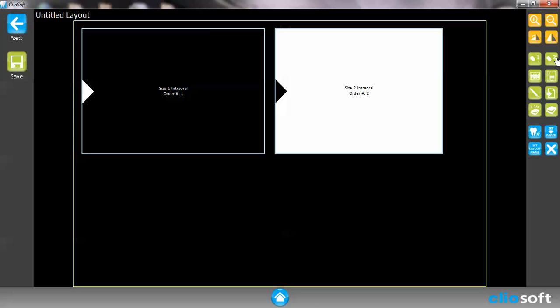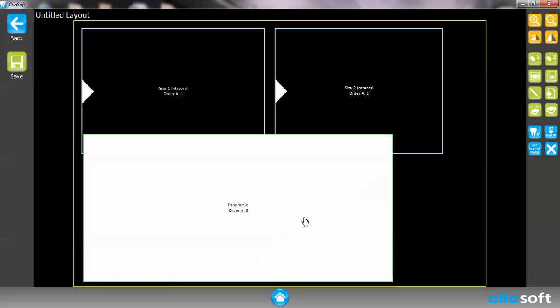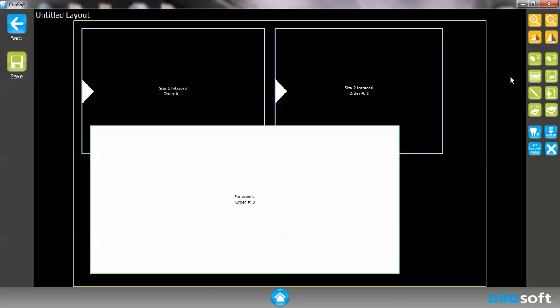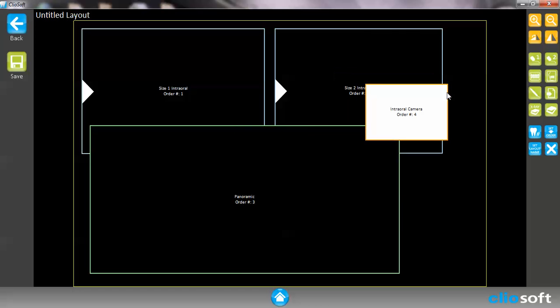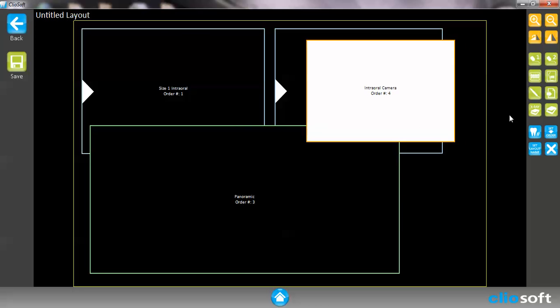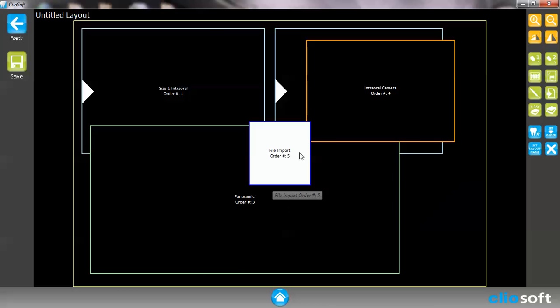We can go down and add a panoramic placeholder. So if you're using a digital pen we can include a pen image. If you're using an intraoral camera we can add our own intraoral images. If you wanted to add an import, now this is also important. If you wanted to import existing images onto your ClioSoft placeholders you can't use just any placeholder. You have to use an import placeholder.